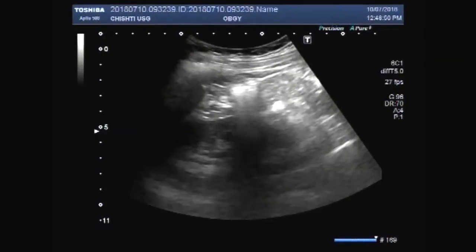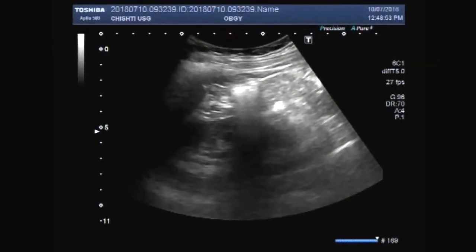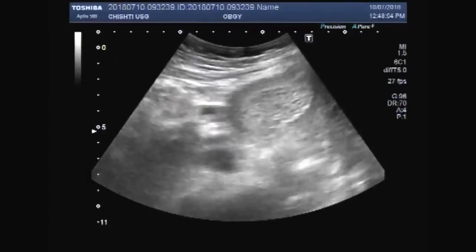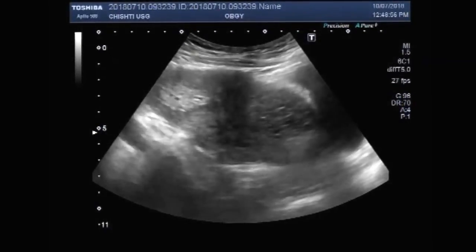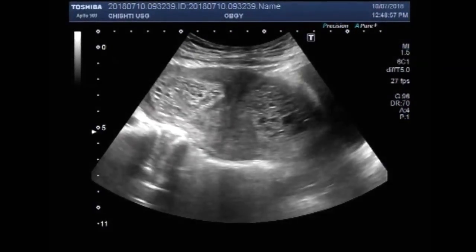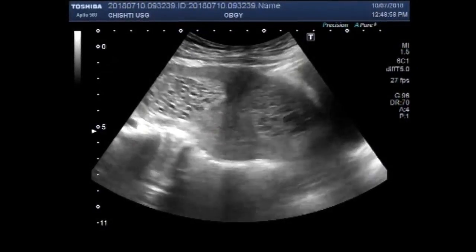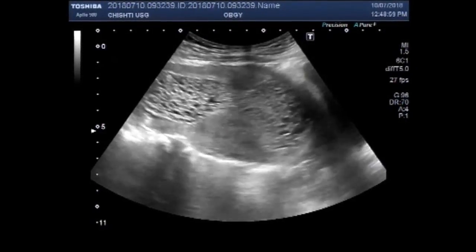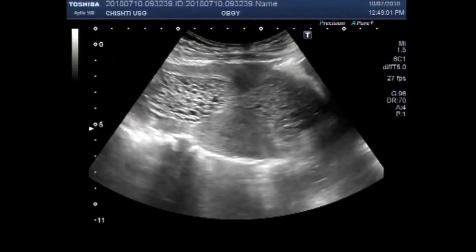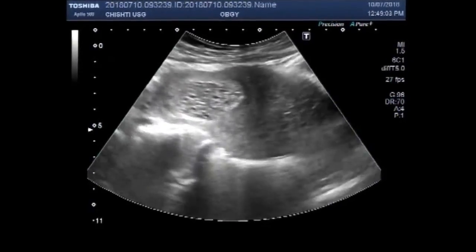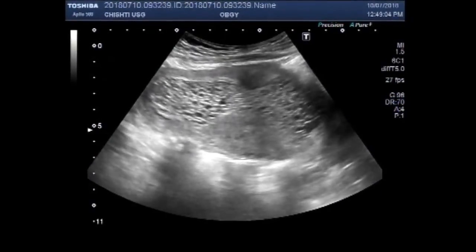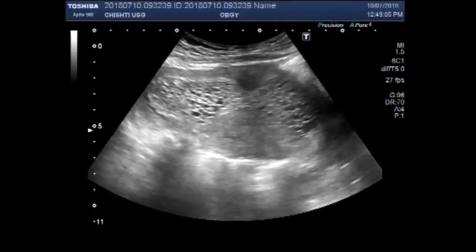Dear viewers, I hope you are all fine. This ultrasound video shows HMOL, also called Molar Pregnancy — Hydatidiform Mole.